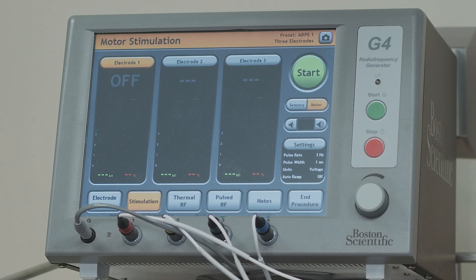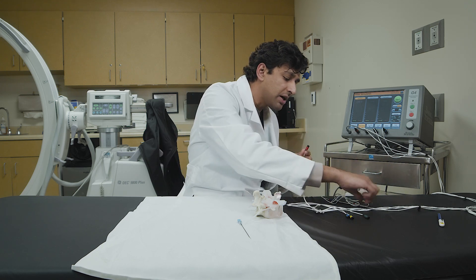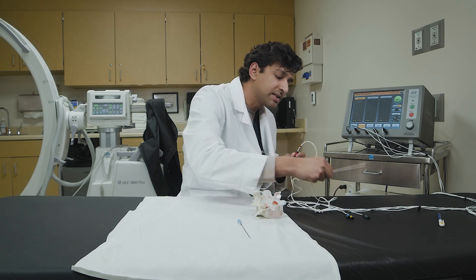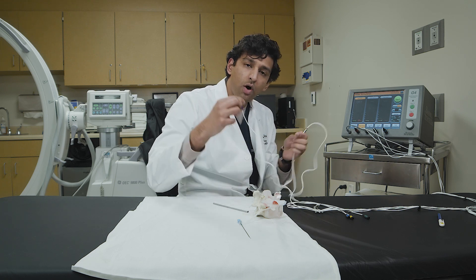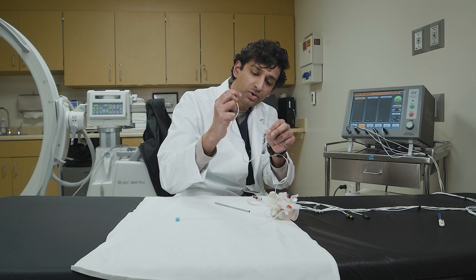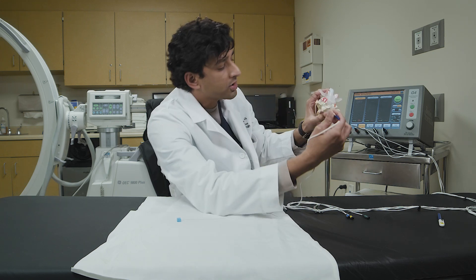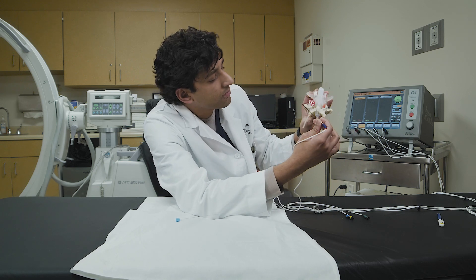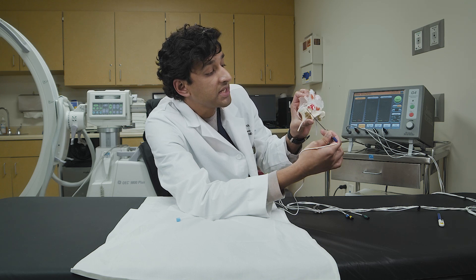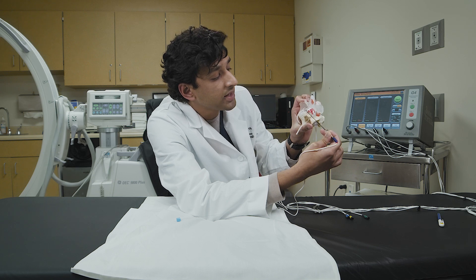Let's take a look at the equipment. This is a radiofrequency ablation machine. It uses its energy to create an electrical current that travels through the wiring system to the wire tip. The wire tip is connected to a conduit piece called a probe. Once the needle is appropriately placed next to the nerve we want to burn, the stylet is removed and the probe goes in, taking the current to the tip of the needle. When the current reaches the tip, the sides of the needle heat up — they are parked right next to the sensory branches — and the nerve is burned.